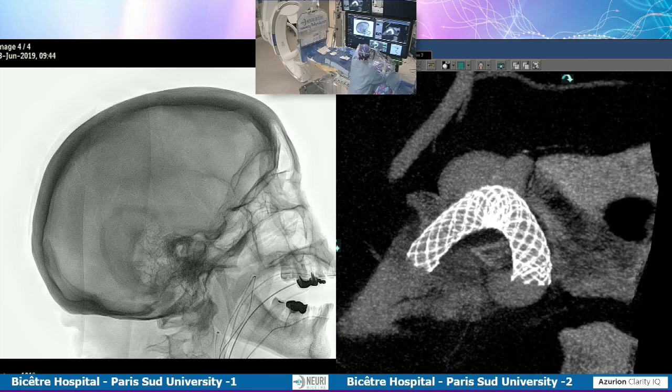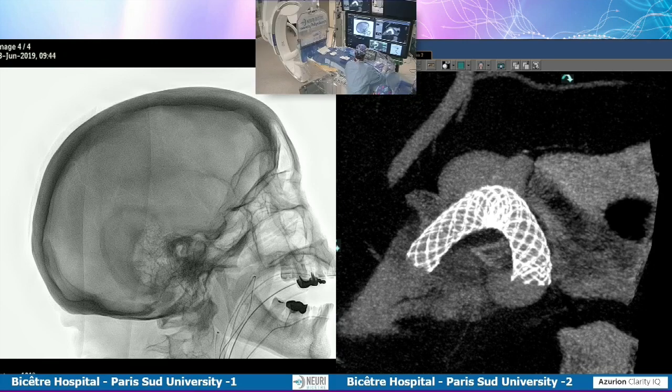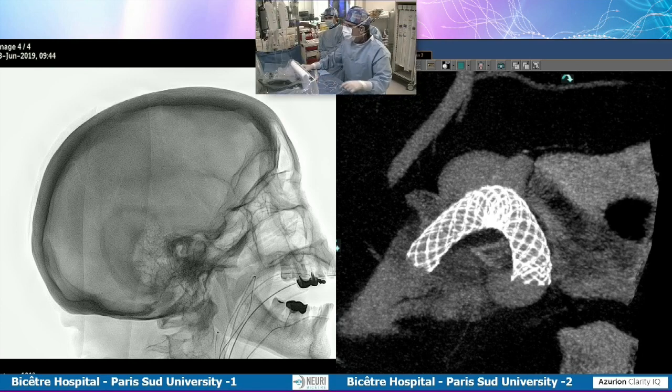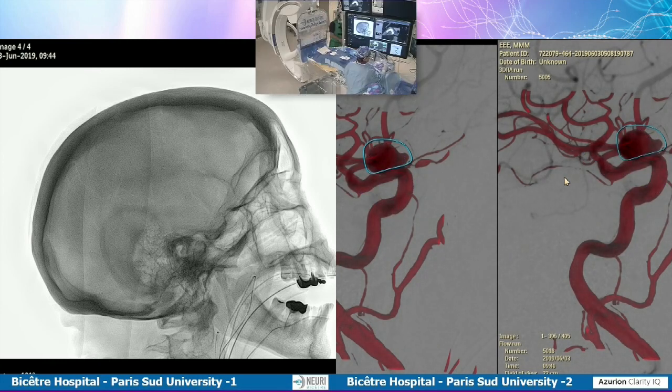So I will show you also the flow study. Ah, I don't have the extravision 2. Can you send the extravision 2? I don't have control. Pretty. That's good.